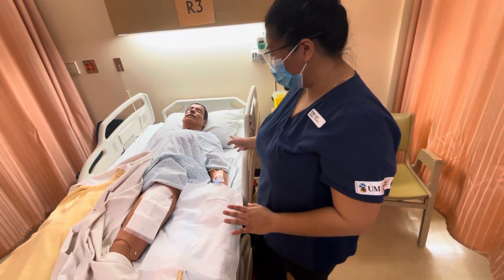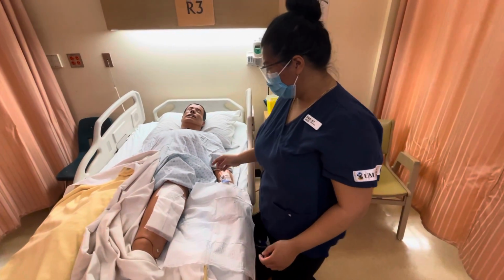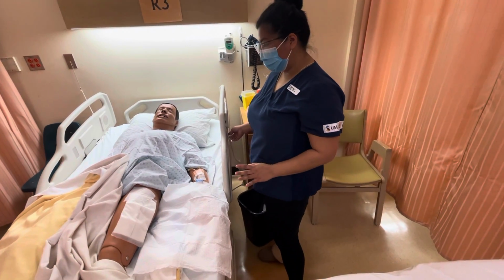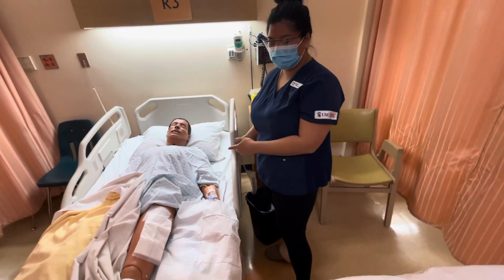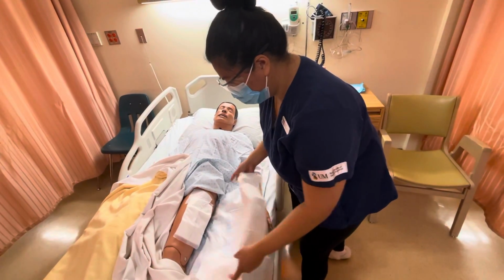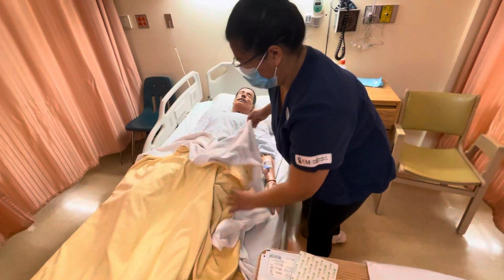So the wound dressing change is now done, and you did very well. We want to make sure that their bed is in the lowest position, and that their call bell is within reach, and their side rails are up, and that they are comfortable. So I'll just remove this, throw it in the garbage.